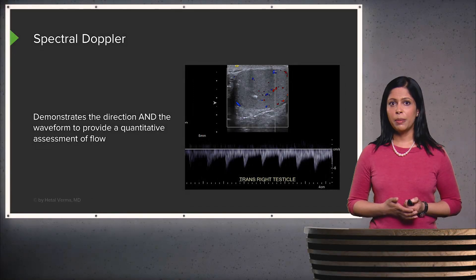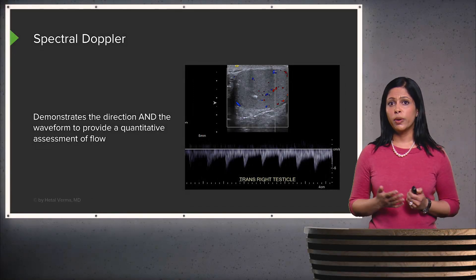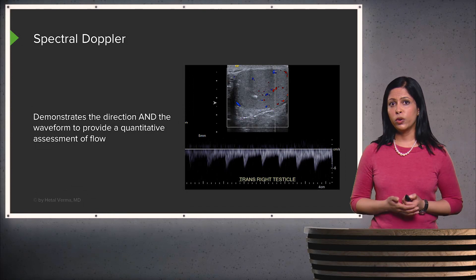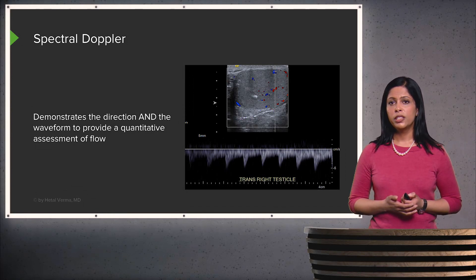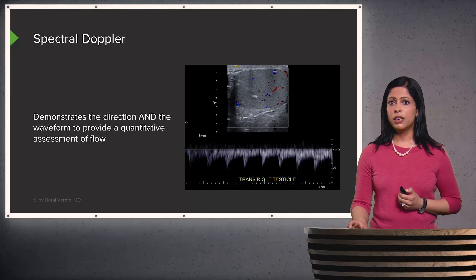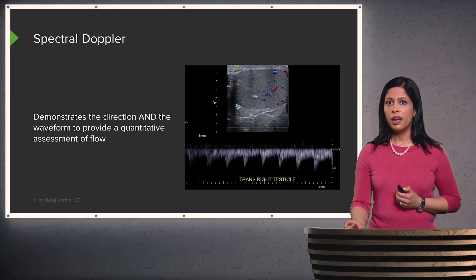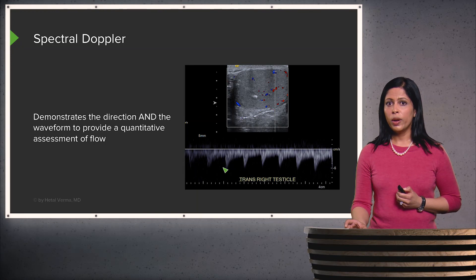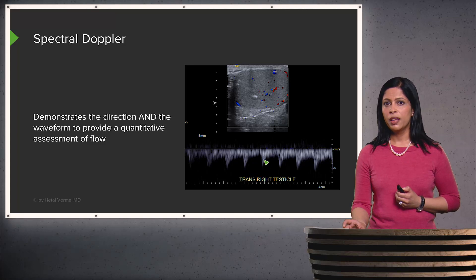Spectral Doppler demonstrates both the direction of flow and the waveform, and provides a quantitative assessment of flow. Here on the testicle image, you can see color flow above, and then the Doppler flow which shows the waveform of the flow. This looks like an arterial waveform with a peak and then a downslope.